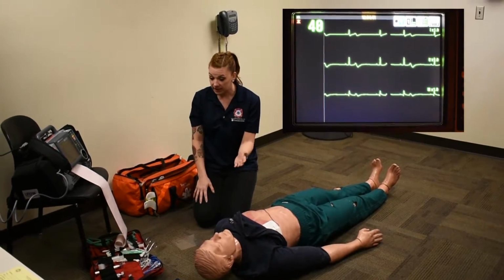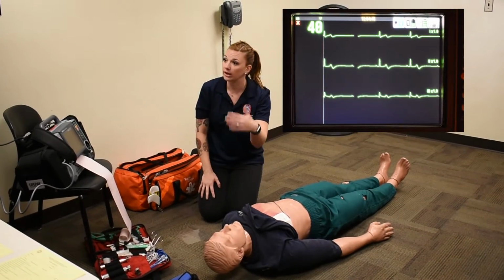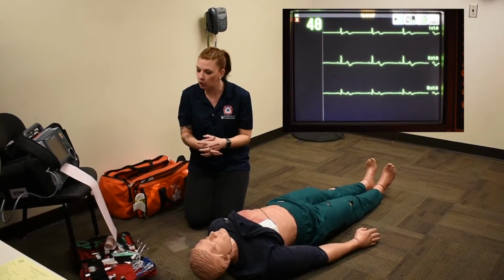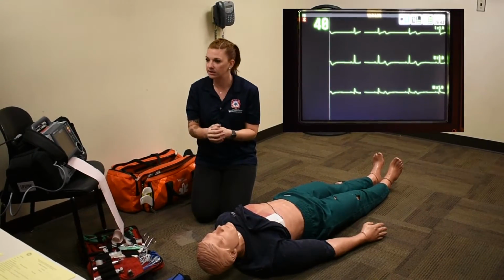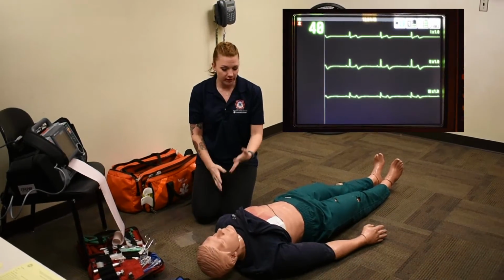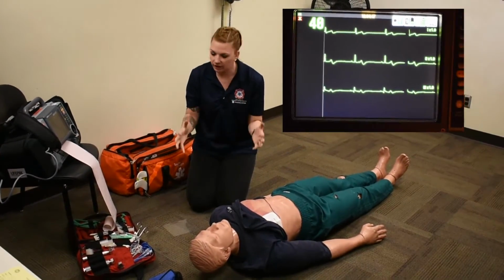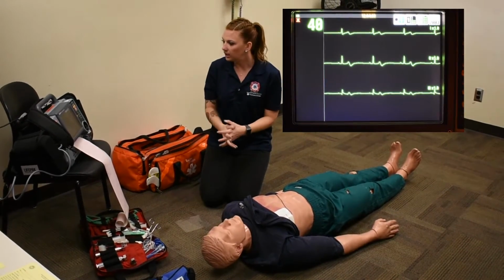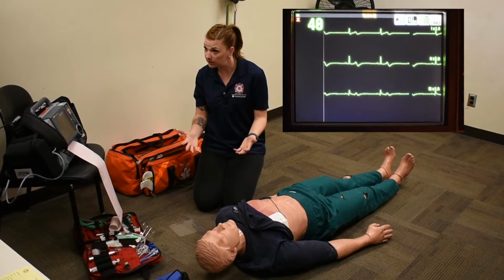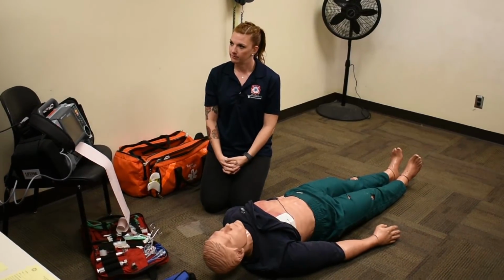I have my advanced airway, so I want to maintain an end tidal. I did a 12 lead in the first place to rule out ischemia, so we can still at that time go to a hospital that has a cath lab or our closest hospital at that time. So I have my dopamine, I have my ROSC protocols covered here. I did a 12 lead. I'm going to reassess my patient every 3 to 5 minutes due to instability and get them to a hospital as quickly as I can. Okay, thank you.